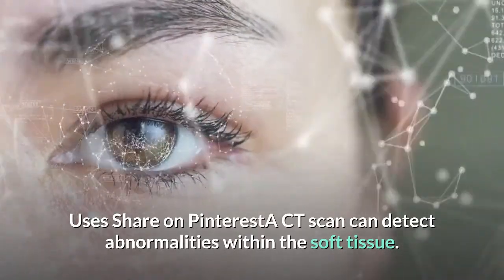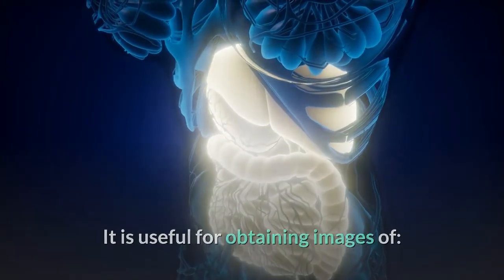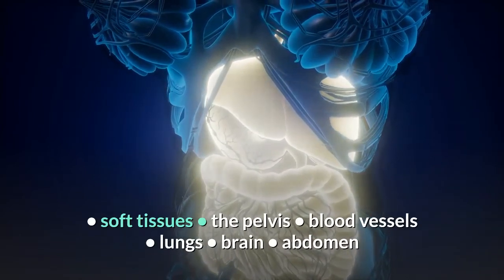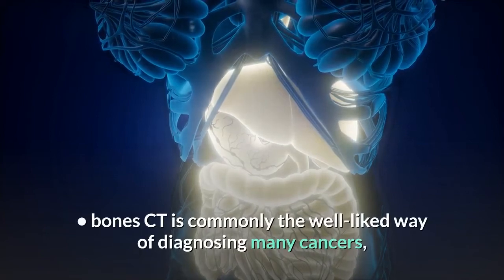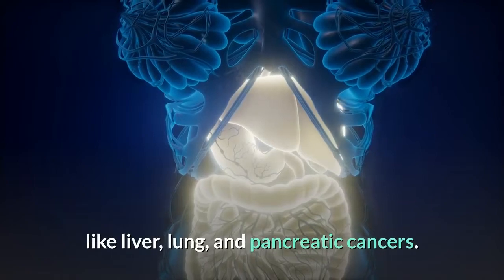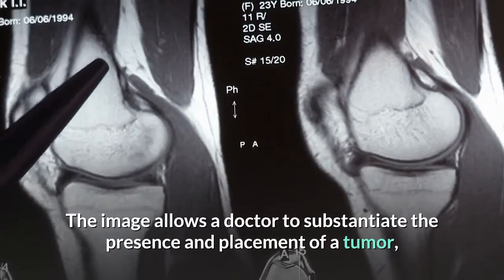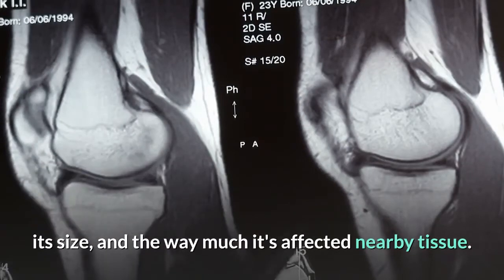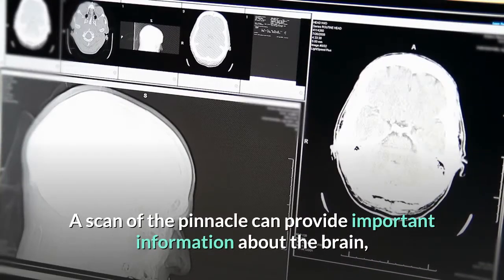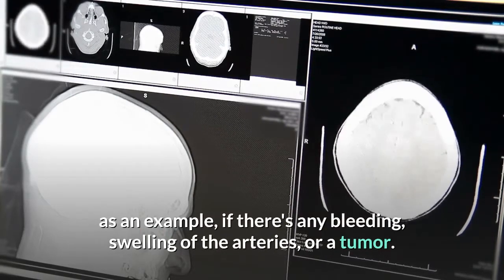Uses. A CT scan can detect abnormalities within the soft tissue. It is useful for obtaining images of soft tissues, the pelvis, blood vessels, lungs, brain, abdomen, and bones. CT is commonly the preferred way of diagnosing many cancers, like liver, lung, and pancreatic cancers. The image allows a doctor to confirm the presence and location of a tumor, its size, and how much it's affected nearby tissue. A scan of the head can provide important information about the brain, for example, if there's any bleeding, swelling of the arteries, or a tumor.